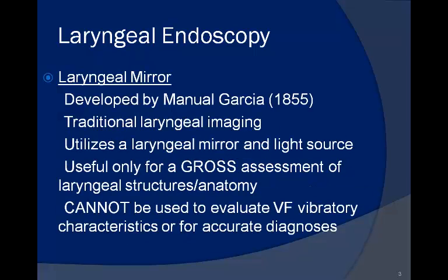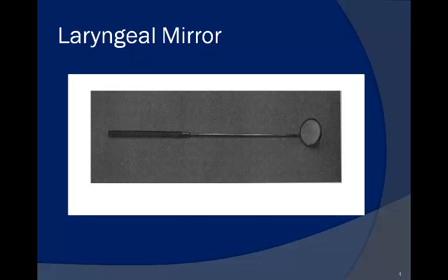The laryngeal mirror exam was developed by the well-known opera singer and singing teacher Manuel Garcia in the 1850s. It soon became the standard of care for examining the vocal folds. Some ENTs still use the laryngeal mirror exam to obtain a gross view of laryngeal structure, anatomy, and gross function. However, assessment of the vocal fold vibratory characteristics is not possible with the laryngeal mirror exam, and diagnosis should be confirmed by endoscopic exam, preferably video stroboscopy. This is a photo of a laryngeal mirror.